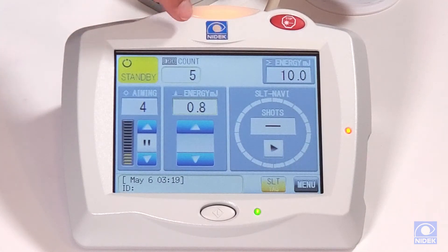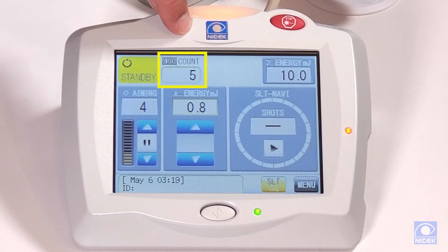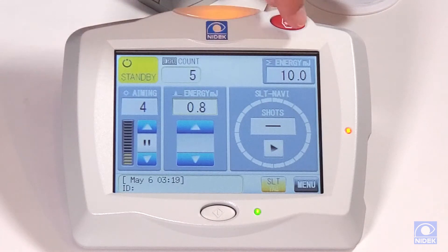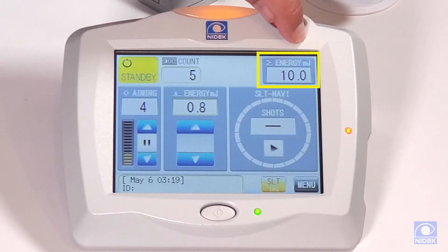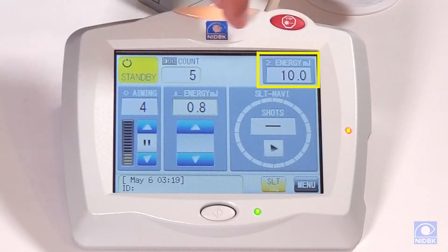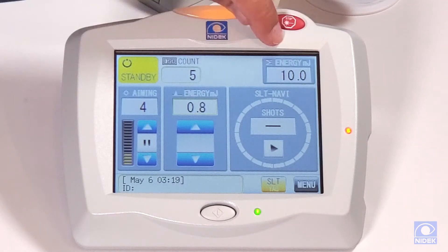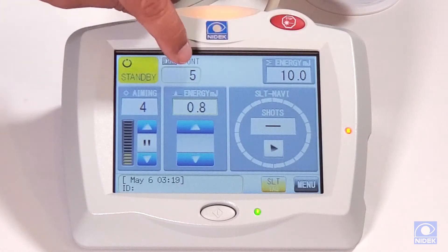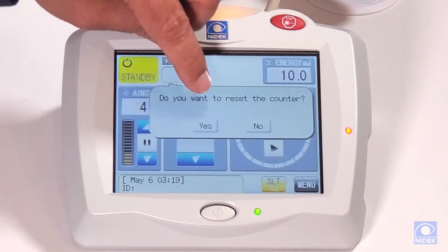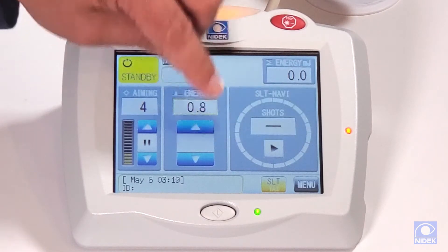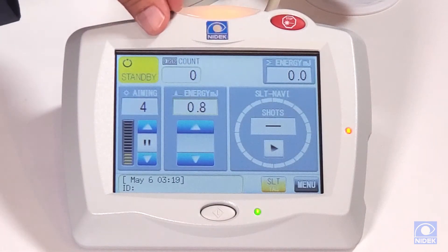We have our counter for the total amount of shots taken, and then our energy, which is the total amount of energy that has been delivered. We can reset the counter and total amount of energy delivered by holding and pressing on the counter and selecting yes to reset.